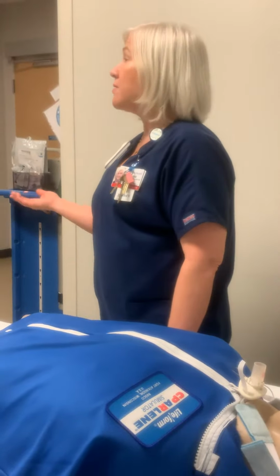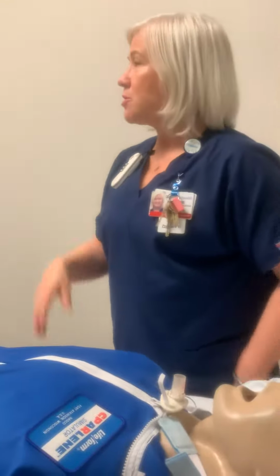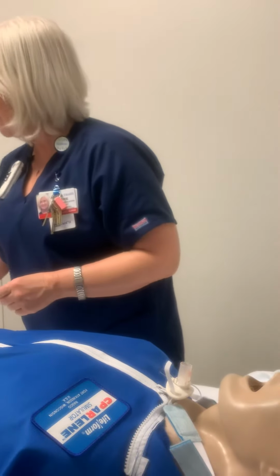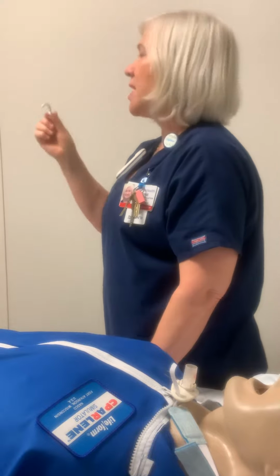If they don't feel comfortable in that event, they reach out to SWAT, and sometimes I'll call Dr. Schellenberger's clinic, Dr. Schellenberger or Dr. Tomei, to come and put your trach back in. But you're welcome to reach out to me, I'll pop over and put it back in for you. But remember, what do I have to have at the bedside? My obturator. Because if the physician comes over, the first thing they're going to ask for is an obturator.